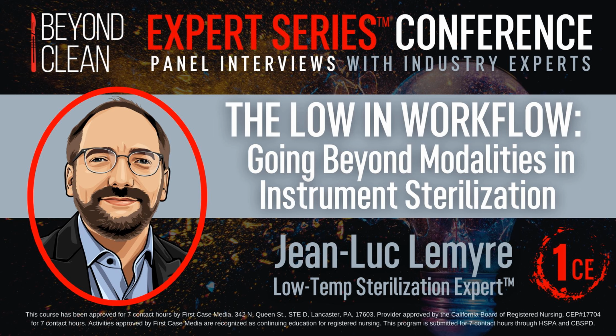So be it ice that remains there, or even if you cool down some surface, peroxide will condense there. And if you get too much condensation of peroxide, it's possible that at the end of the cycle there could be droplets of peroxide left in the load. So that's obviously a danger for exposure. So cycle abort and potential exposure are reasons not to let water in the load.